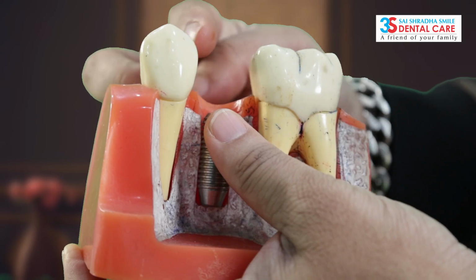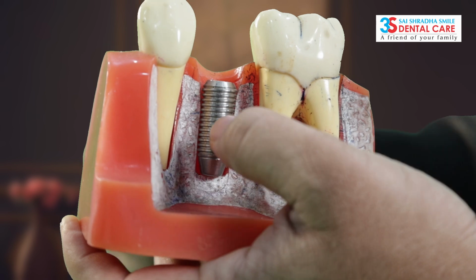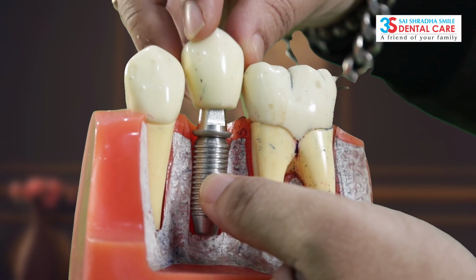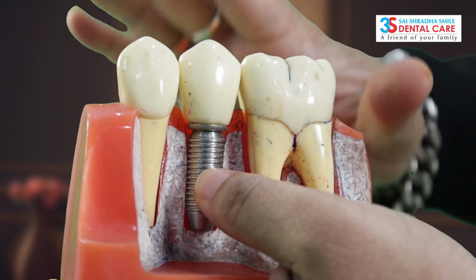Implants means, suppose there is a missing tooth and we want to replace it with a permanent solution, that is a titanium screw, grade 5 titanium. This is the implant which we can place in the missing tooth area, and after that we have to wait for a period of 3 to 6 months. Then we can place the second part, known as the abutment. After placing the abutment we can place the crown. So this is how we replace a missing tooth with a titanium screw, known as an implant. This is in short.